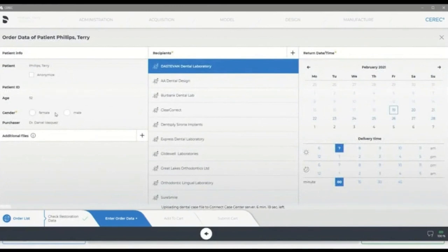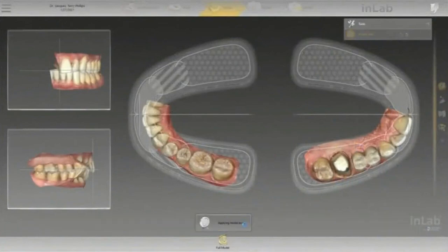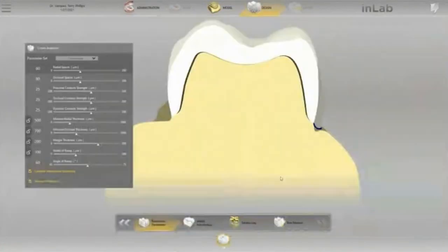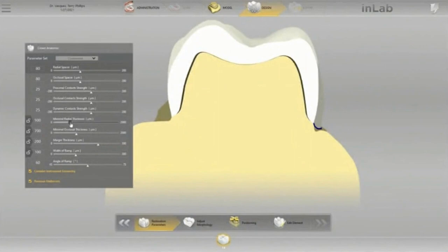This is the prescription that I'm doing. This is a male patient. I'm going to send it to myself, and the next thing I'm going to do, I'm going to open this in my in-lab software, and we'll be designing this restoration. So this is the lab software. This is not the chairside. This is the lab software. And I'm already designing my restoration.